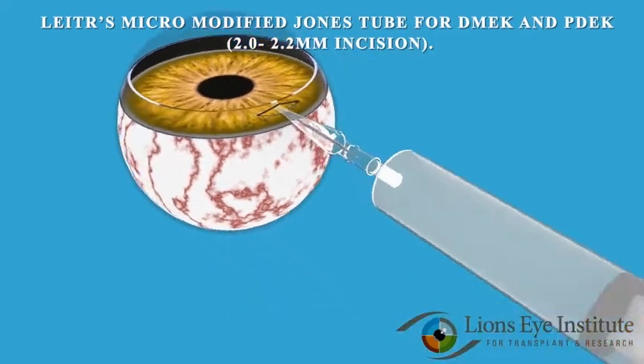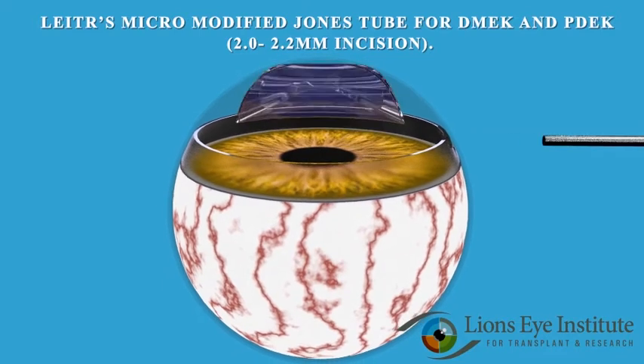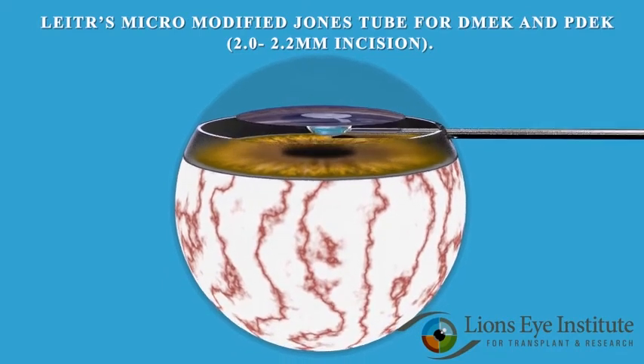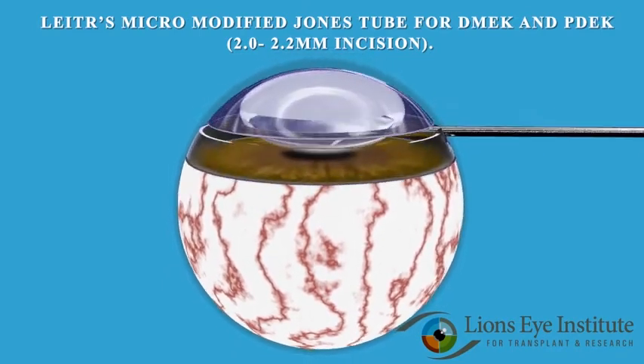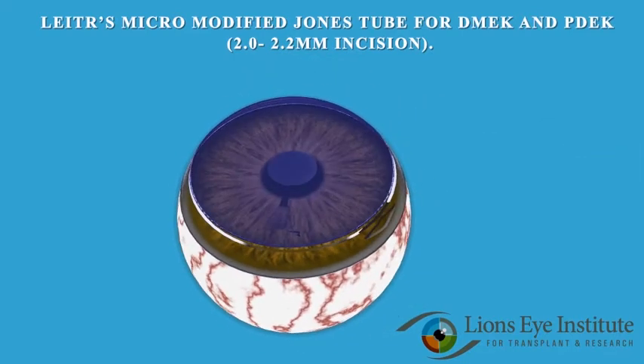The new injector can be preloaded with DMEK or PDEK grafts in advance at the Lion's Eye Institute for Transplant and Research, or if preferred, the surgeon can load the graft into this injector in the OR prior to surgery.